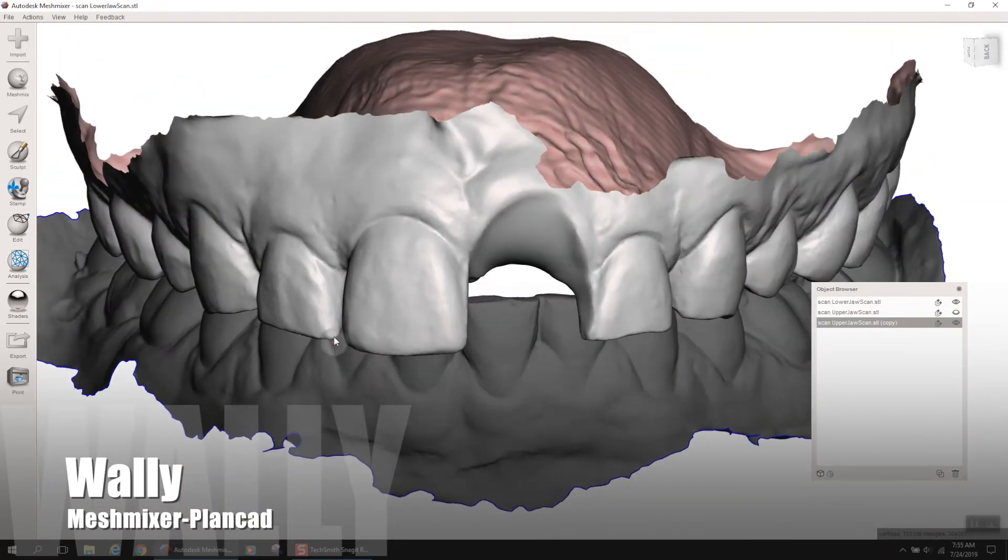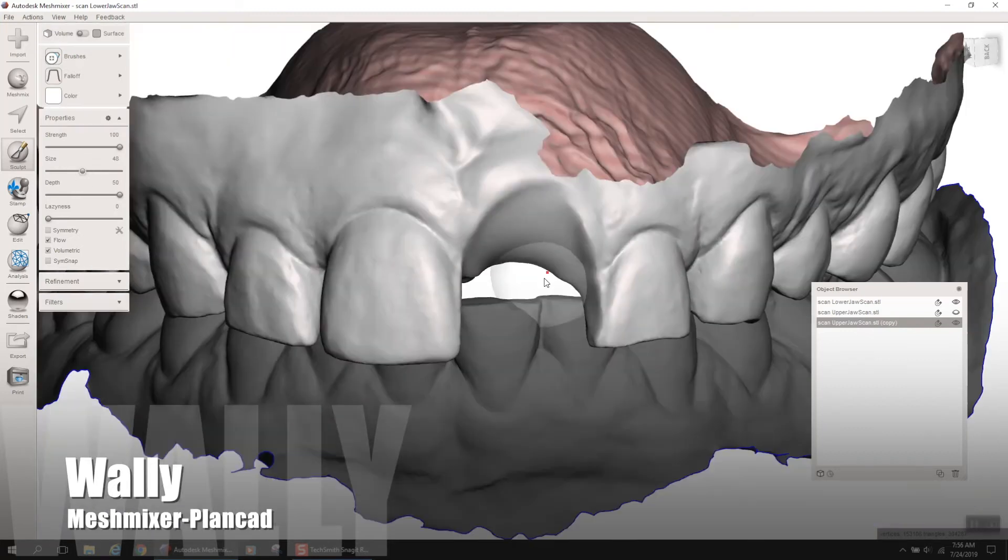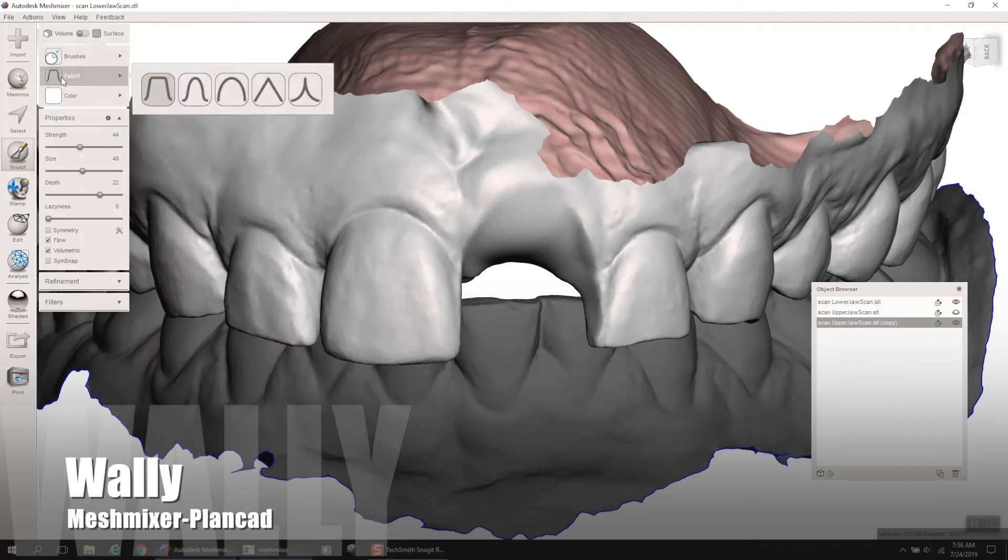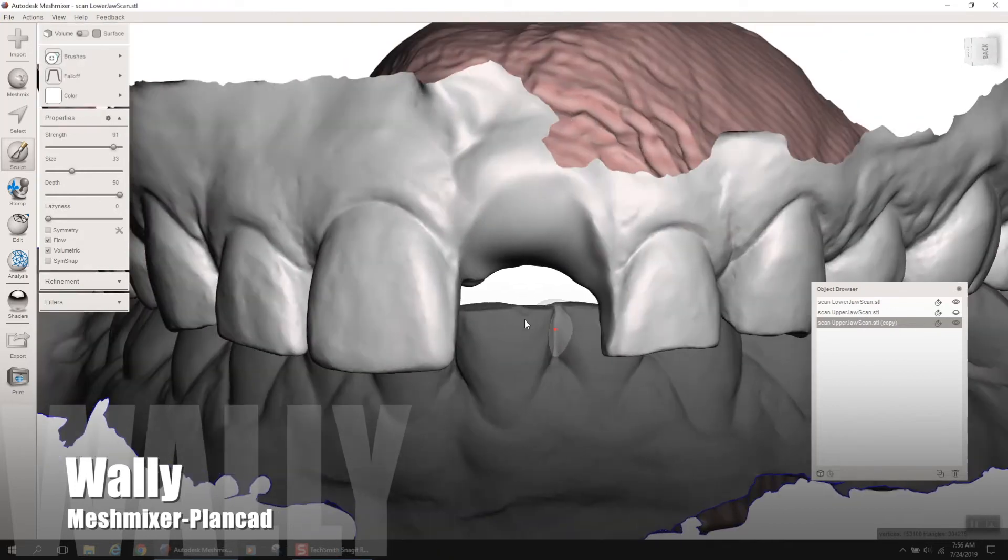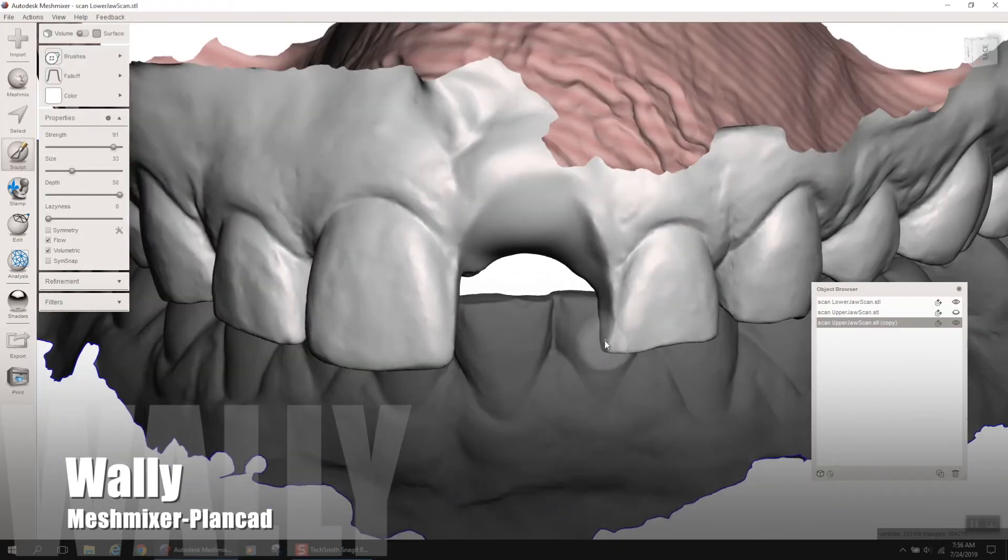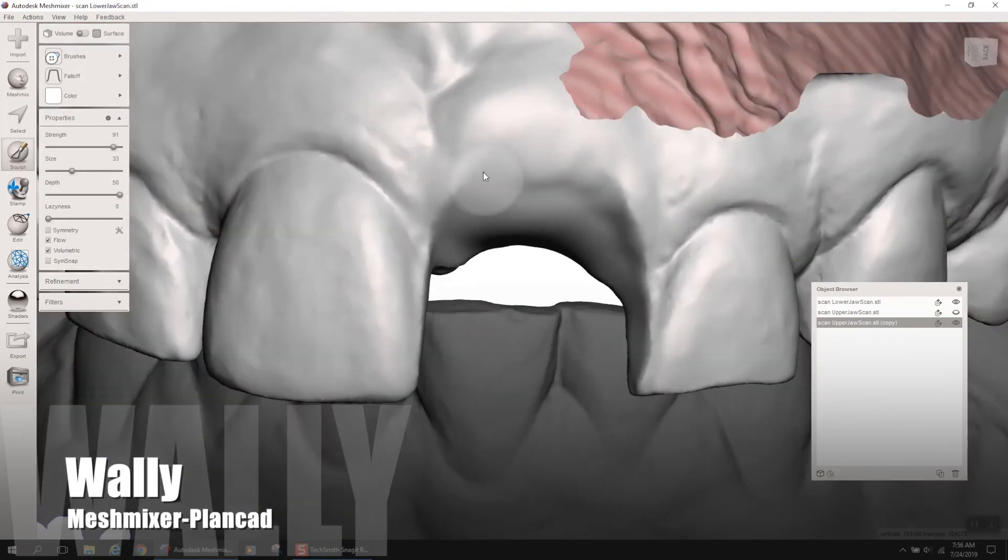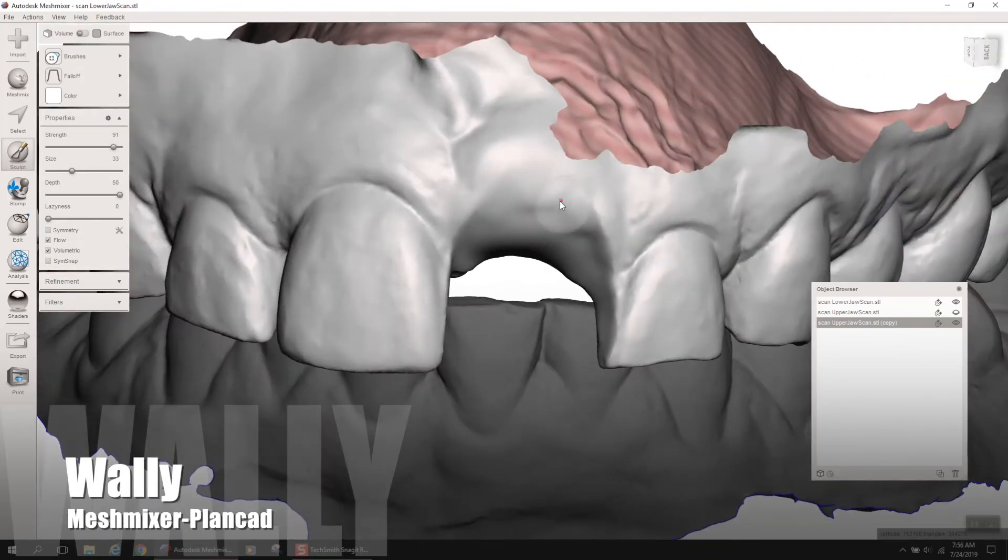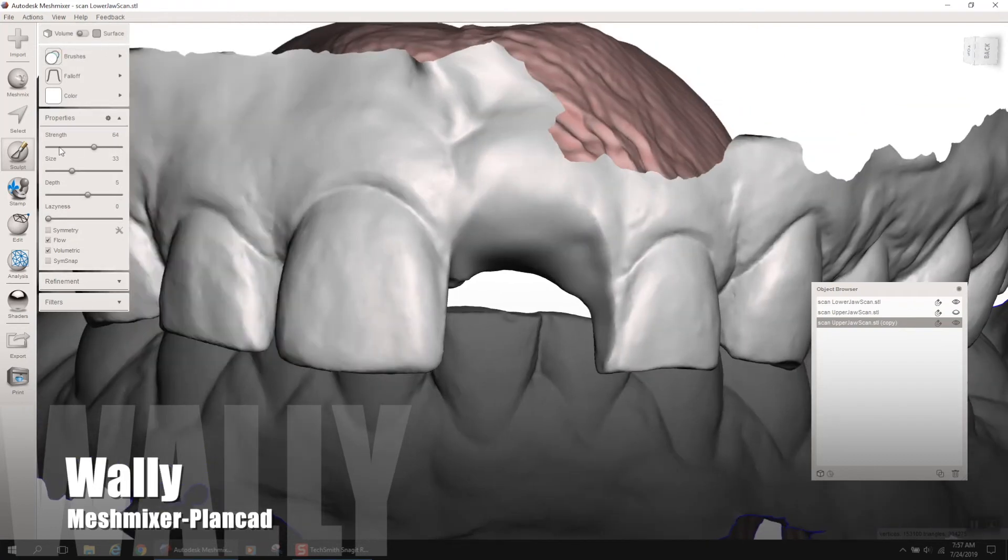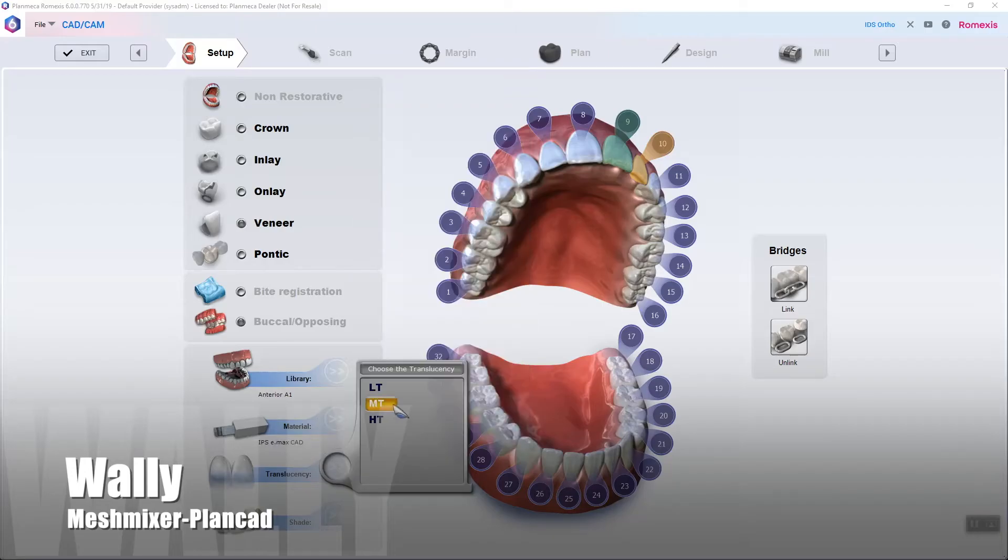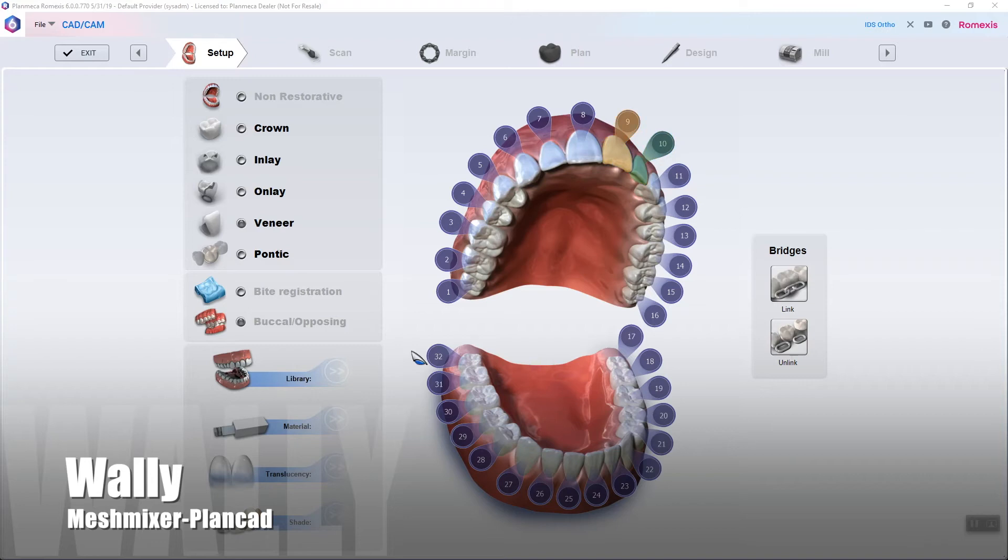But bubble smooth will kind of puff up the tissue just a little bit. And so, just alter between bubble smooth and inflate and robust smooth to get what you want. And here, we're going to do a little bit of grafting, some bone grafting, and some tissue work here when we extract this tooth. So, we're hoping that tissue kind of comes down a little bit on the day of surgery. So, I'm trying to mimic that a little bit by adding a little bit of material.